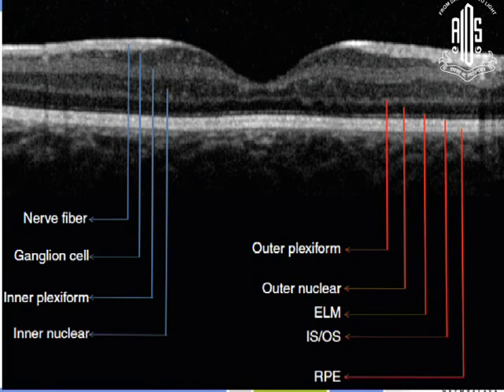This middle layer is often not given a name in adult OCT, or it's called the COST, the cone outer segment tip. However, in pediatric OCT, and a lot of this work is done at Duke University, we have a name for another layer, which is called the OSRPE, or the outer segment RPE. So it's really in between the ISOS and the RPE.